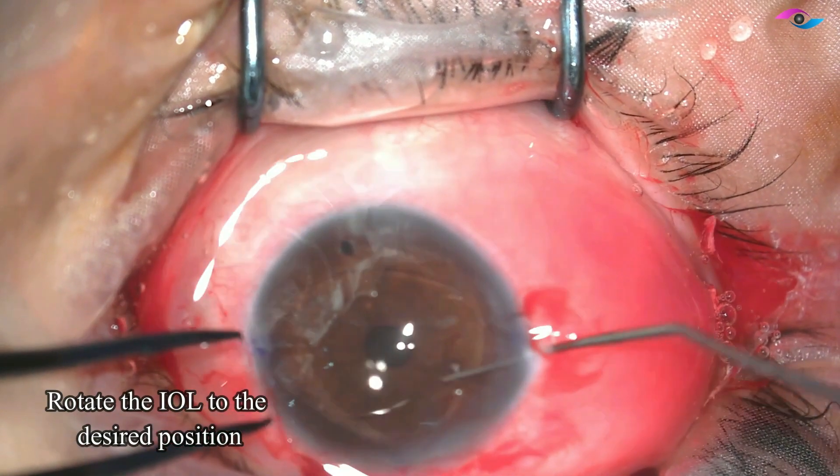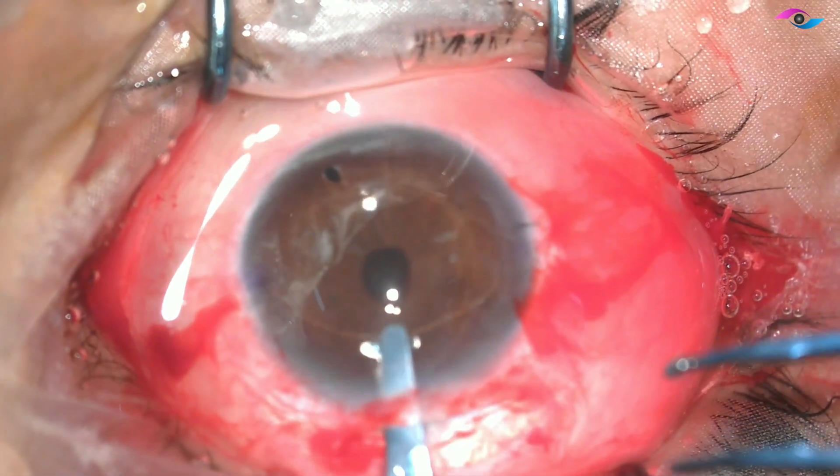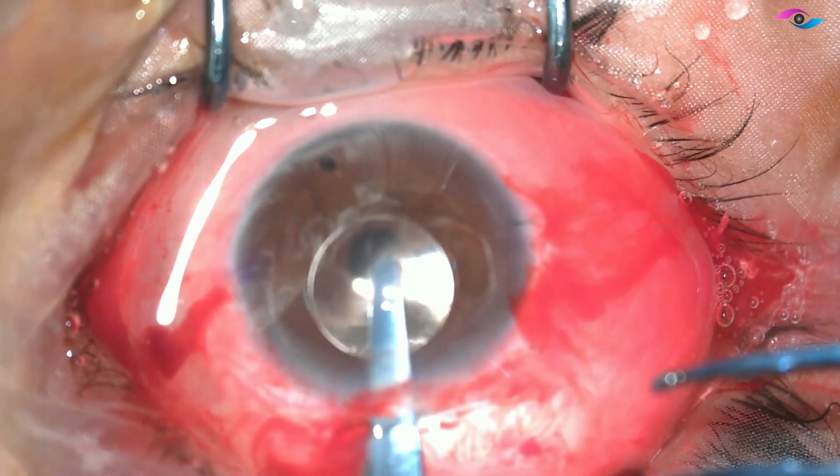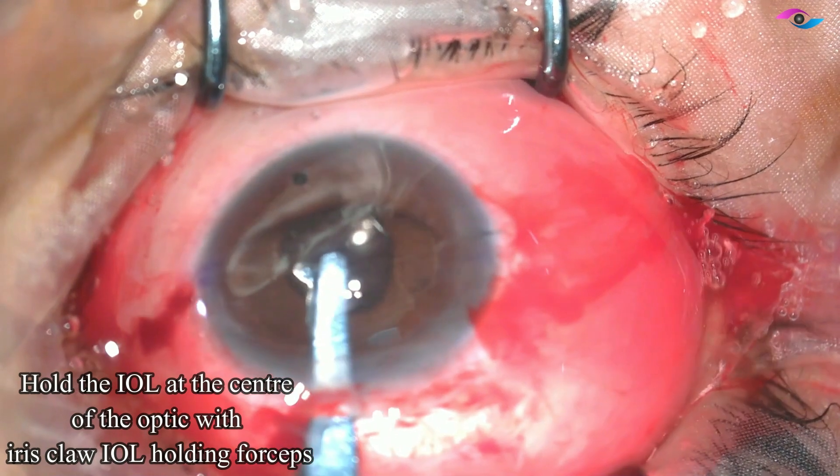Then by using a dumbbell dialer I am rotating the IOL to the desired position where I have already created my side ports. Now I am taking the special iris claw holding forceps and holding the optic right at the center.